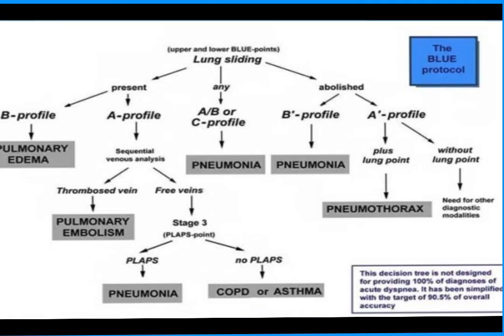Now let's go over the BLUE Protocol. The BLUE Protocol was a protocol made by Dr. Lichtenstein. It's an acronym for bedside lung ultrasound in emergency. In 2008, Lichtenstein and his colleagues wanted to come up with a quick, easy way of diagnosing different lung pathologies in critical care patients.